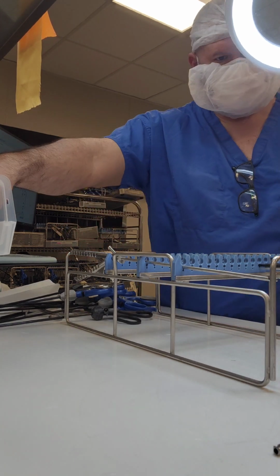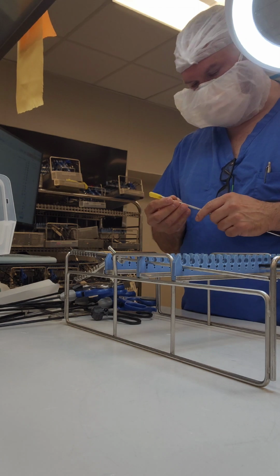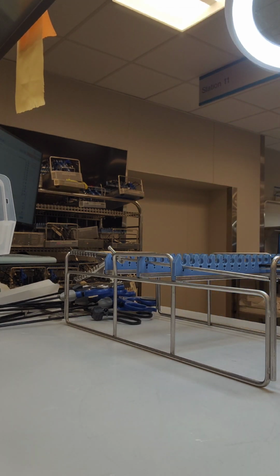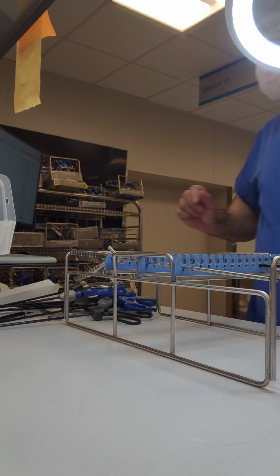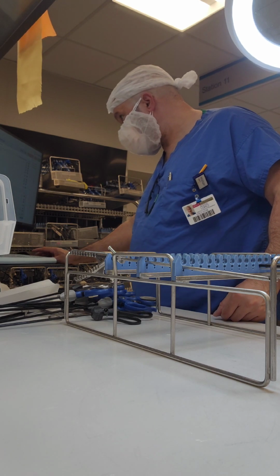What am I looking for here? Oh, tip protector there. This was actually one of the injection needles. Our count sheet stated that we put a tip protector on there, so I did that. Placed that in the bottom of the basket.